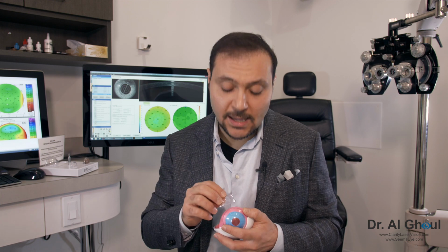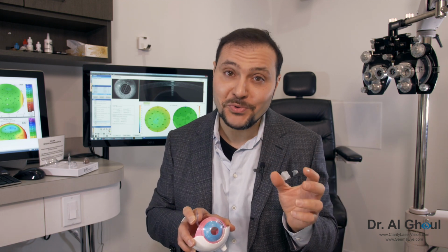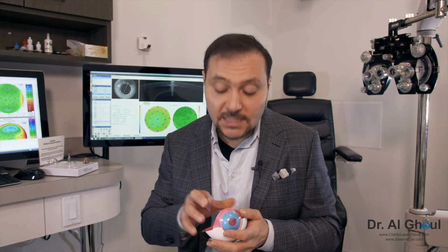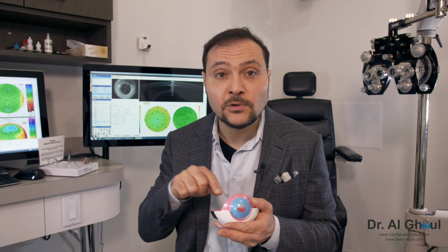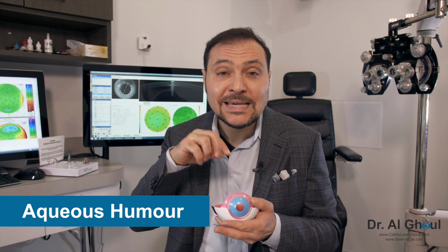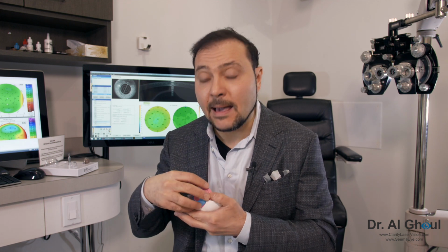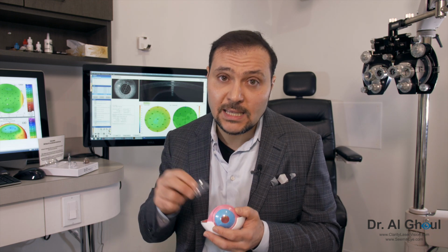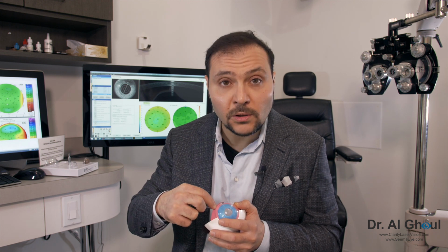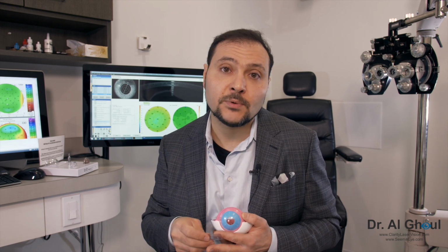When you put an ICL in a very tight compartment space, we're talking about 3 millimeters or more, but not much more space to be able to put a lens, there's going to be a lot going on in that space. And one of the most important things we have to really protect is the flow of what we call the aqueous humor, which is the fluid inside the eye, to be able to get out of the eye to blood vessels that take it to the rest of the body. That action is all happening in this front part of the eye between the pupil and the cornea. So if you're going to put an artificial lens in the eye, you traditionally have to make a little hole in the blue part that you see here to allow fluid to still keep coming through and not create problems like pressure elevation or risks like glaucoma developing in the eye.